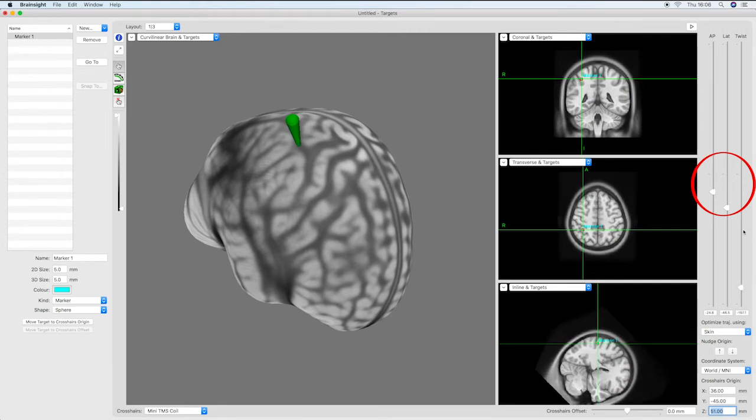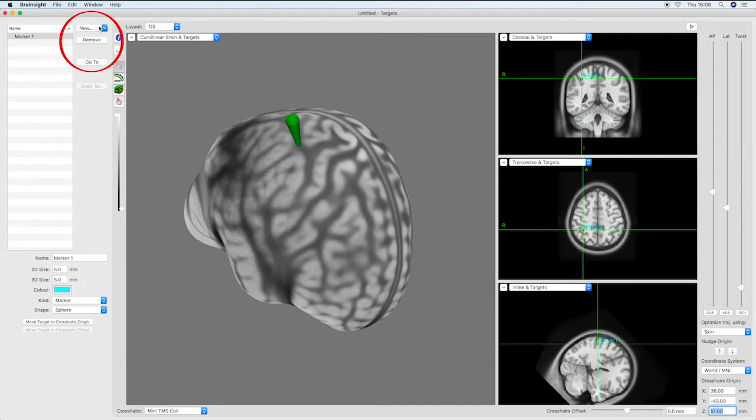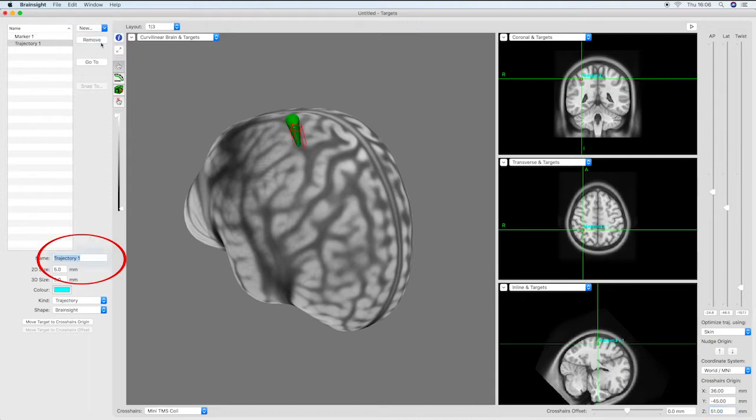Reconfirm that the coordinates entered are still correct or update if necessary, then select new trajectory and enter a suitable name.